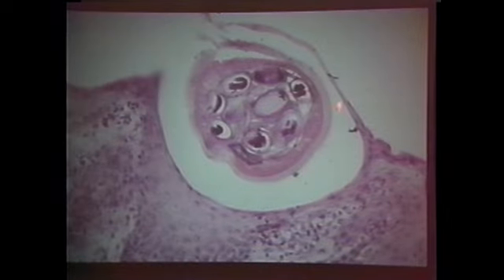This is one that you all know. It's Gongylonema. And you go, well, look, I can't make out those muscles. And I say, well, you know, I have a pretty hard time too. But put it in the group. At least you can go to the group. Look at those eggs. Small, thick shell, and contains an embryo.